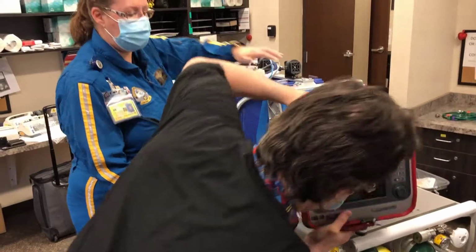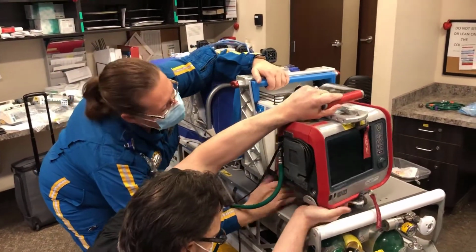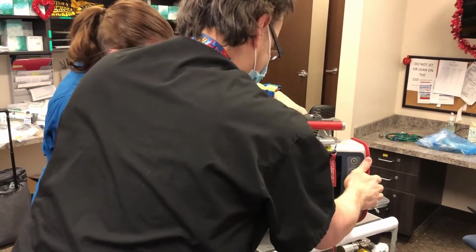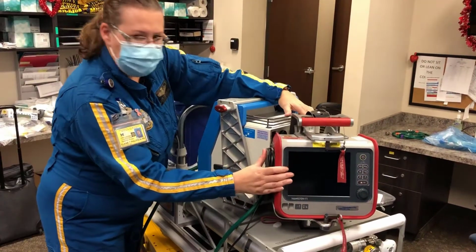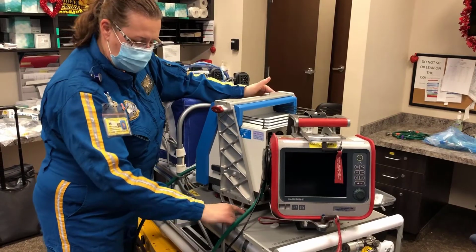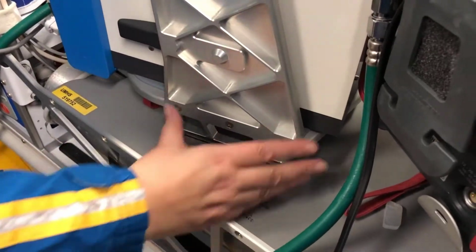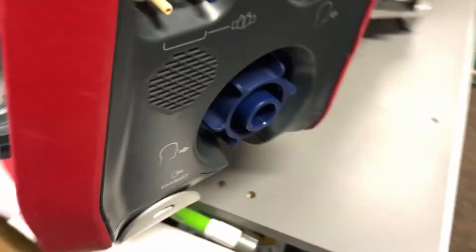So this is probably a 2-man job. And then turn both so that they're locked into position. There is a line that shows you the best position for this so that it locks in place. So both of those are locked into position.